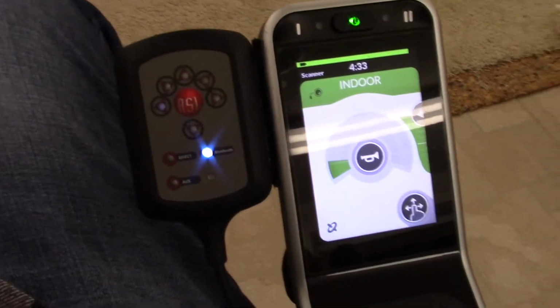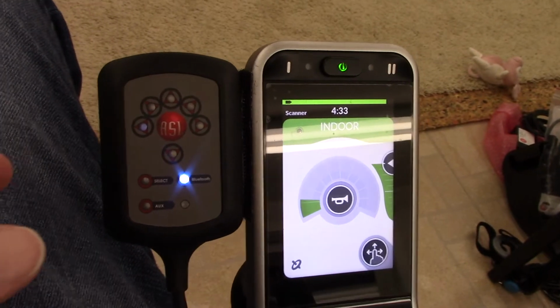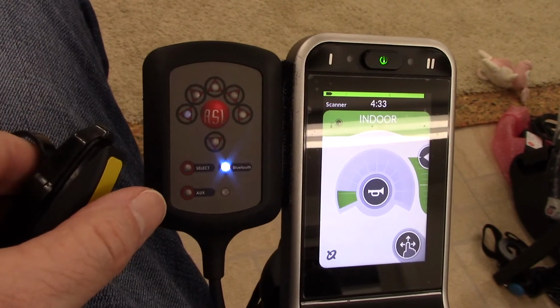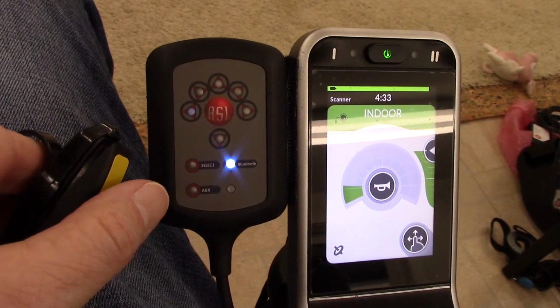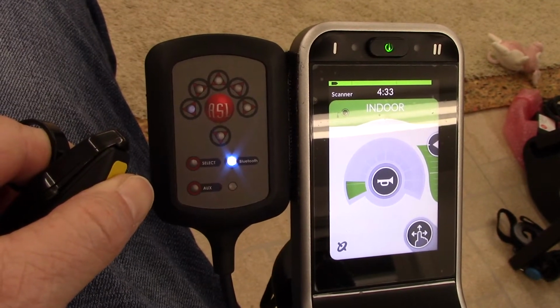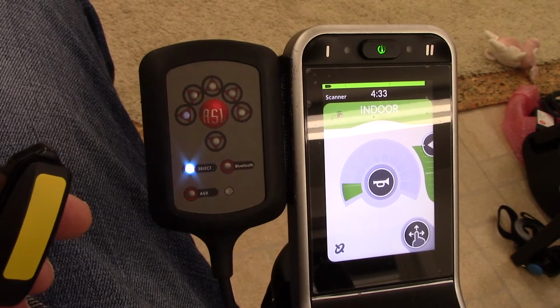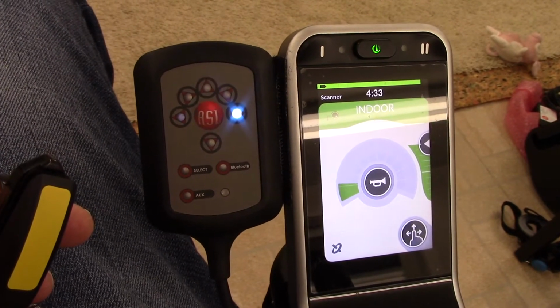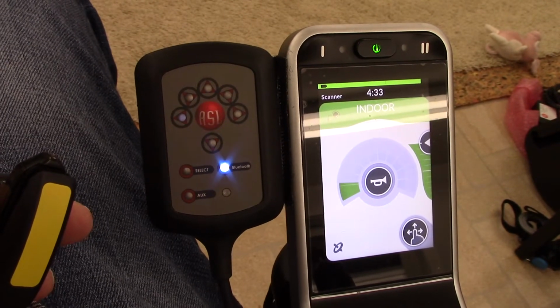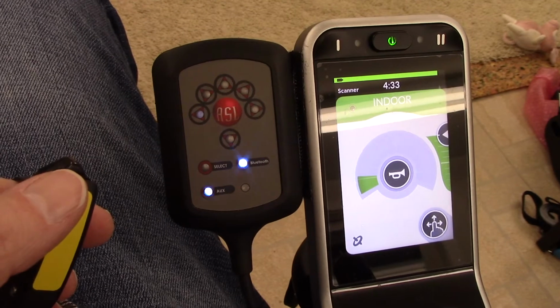And I ought to get back over here. I'm still in Bluetooth mode. How do I get back to driving? Okay, I'm going to hold this for 5 seconds and you'll hear a faint beep. And now it's resumed scanning and I'm back to driving. Okay, I'm going to turn around because I want to show you a communication device that I'm connected to. So I'm going to make a big, sharp turn to the right.